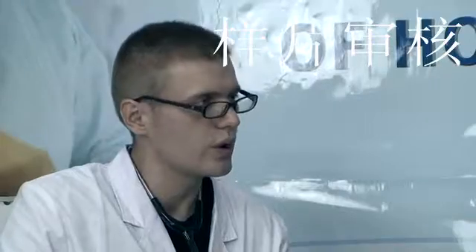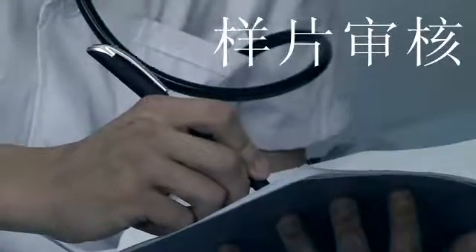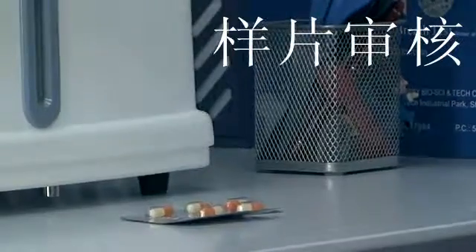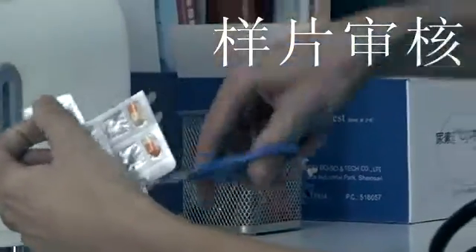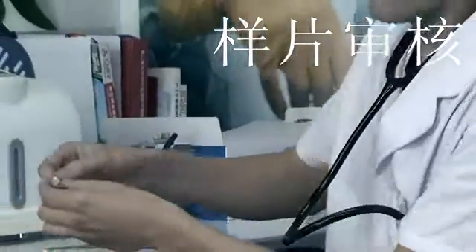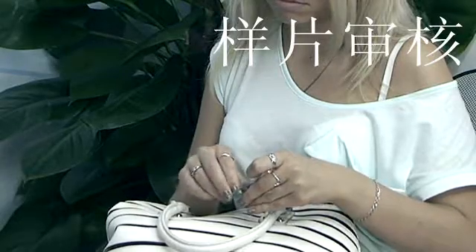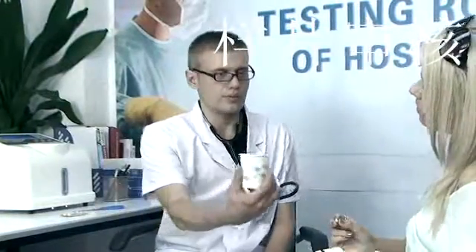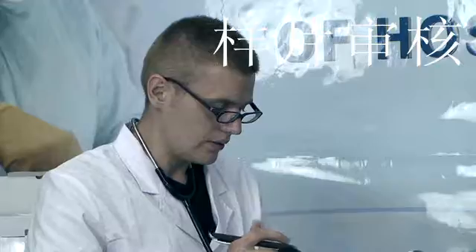Preparation for breath testing should follow the instructions below. First, do not eat food for about 3 hours before doing the breath test. Second, swallow the 14C urea capsule with water. Third, sit and wait for 15 minutes.